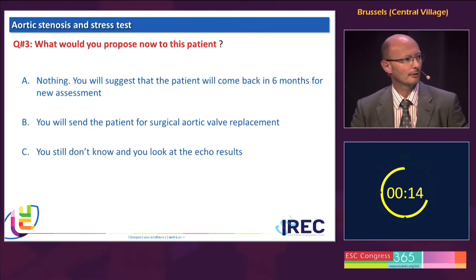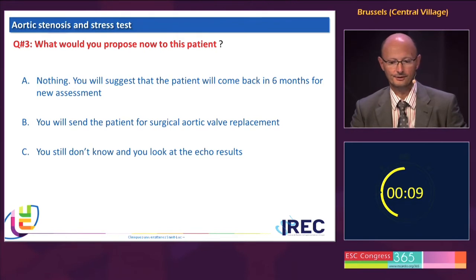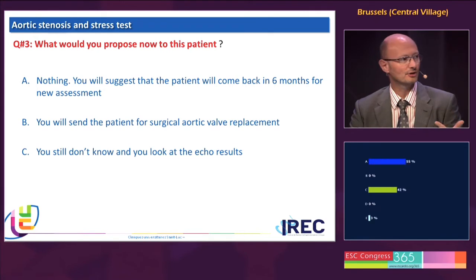It's really, really important, a crucial exam for this patient for 3 reasons. First, you can quantify calcium based on the works by David Messika-Zeitoun and the group of Vahanian. You really have a prognostic impact of the quantification of calcium in these patients. Second, the aortic root, as you said, and third, you can also have the coronary anatomy. So yes, MDCT is crucial in this setting.